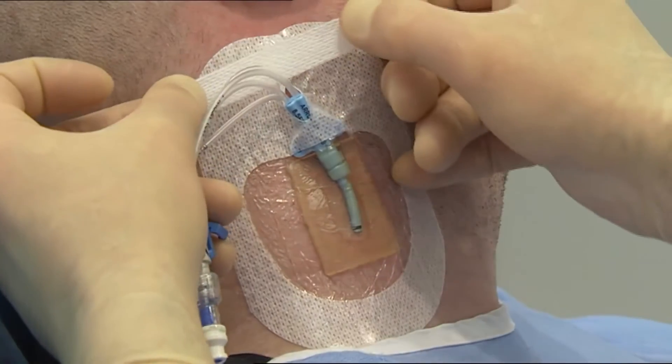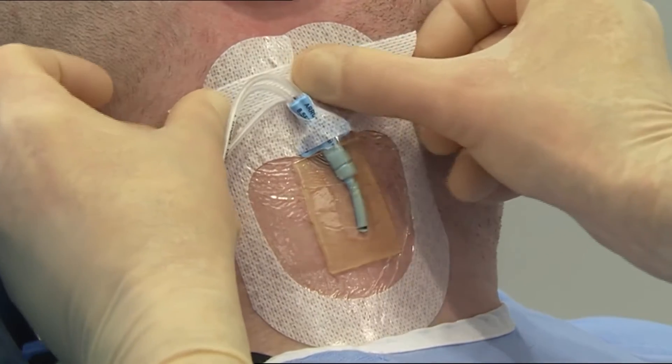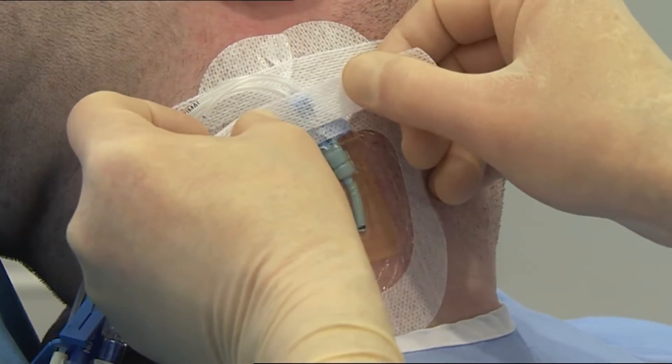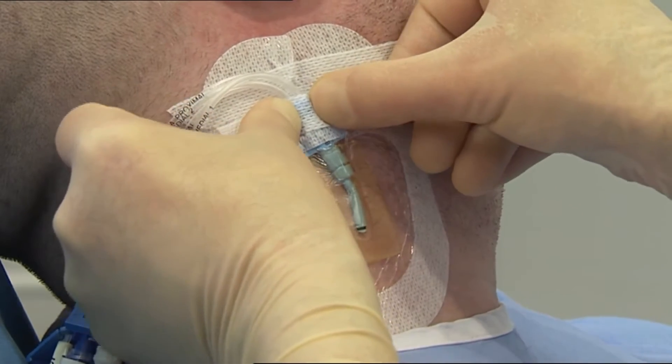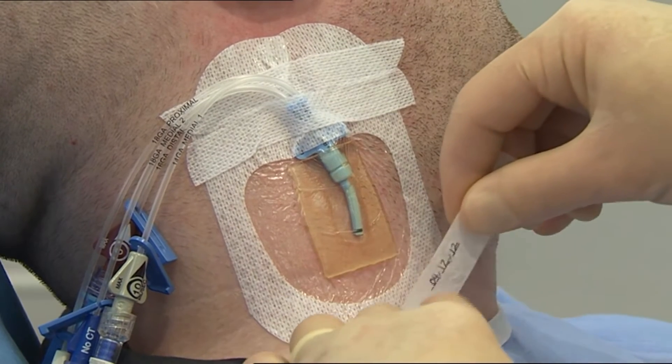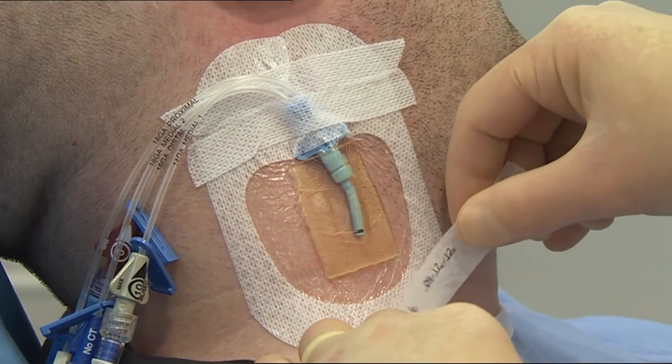Apply the first securing strip under the lumen and across the soft cloth section, and the second one over the lumen. Date the recording label and place it across the dressing for documenting the dressing change.